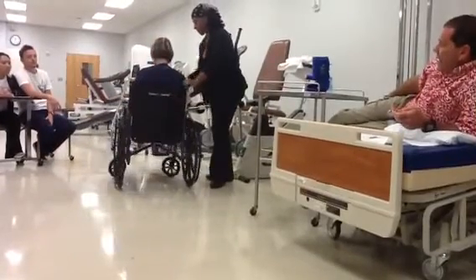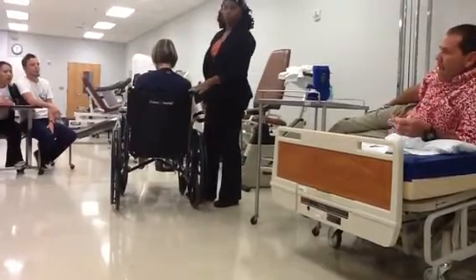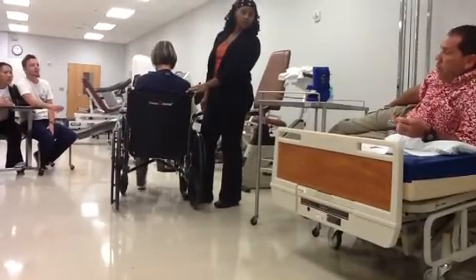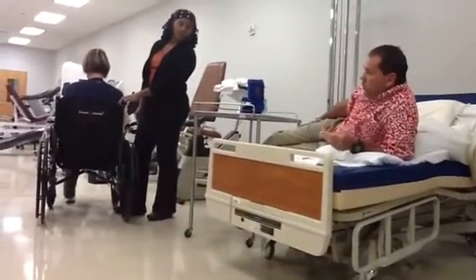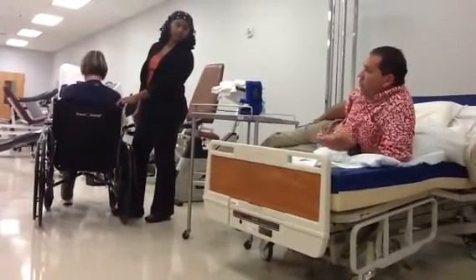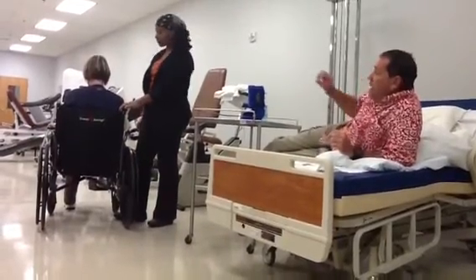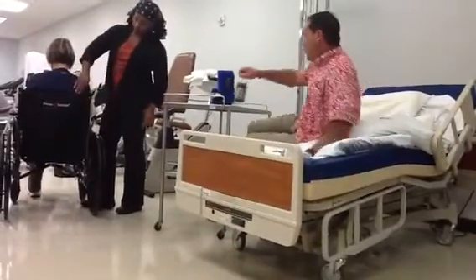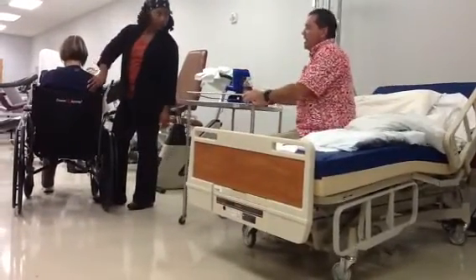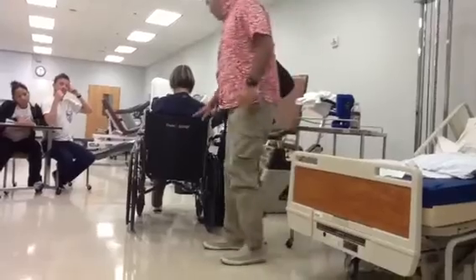What about the back height? You always have to be concerned about back heights on wheelchairs. Because if you go too low, you're not giving them enough support. If you go too high, you're giving them too much support. The major concern for pressure is when the top of that hits the inferior scapular border. That will cause a pressure problem really quick.